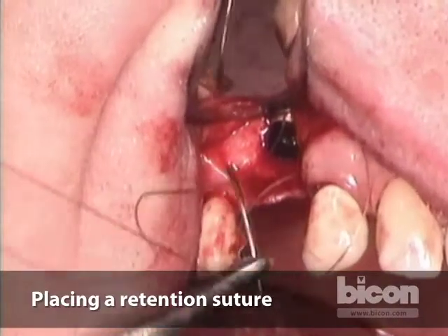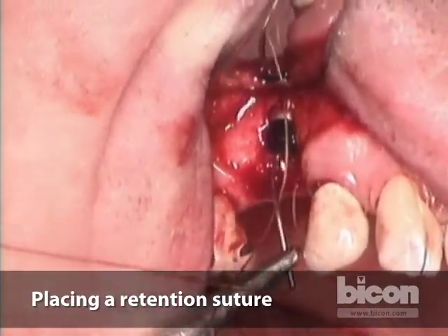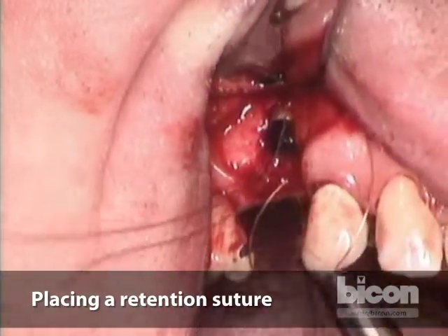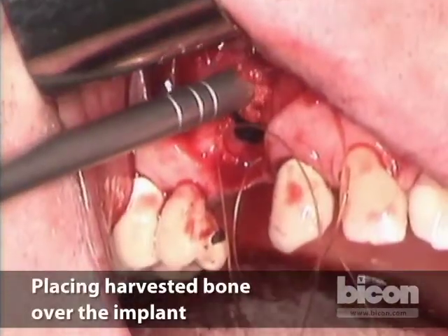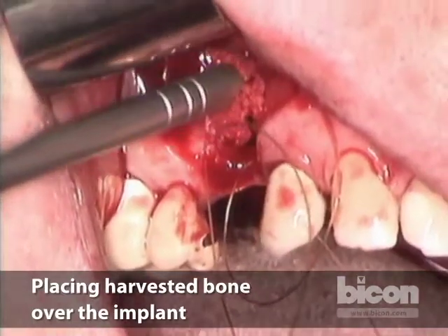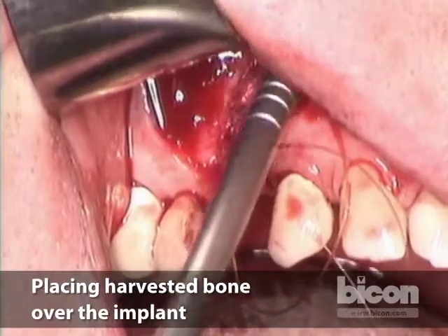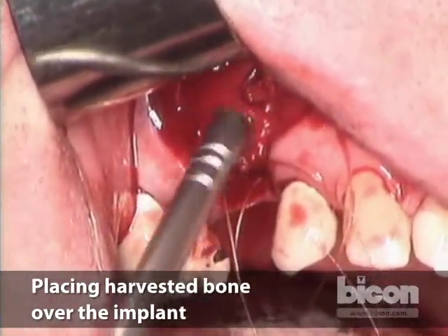And you want to bring it out on the other side of the implant and deep. Okay, this suture will also help reduce this bleeding that's coming mostly from the palatal. And probably the trickiest part is keeping those dangling sutures and all the suture lines straight and keeping them where we want them to be. Now, take this, please. Good.